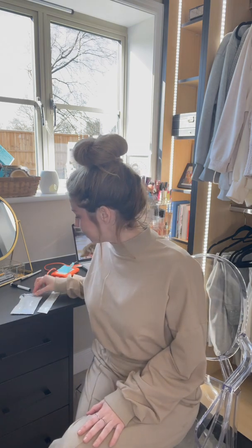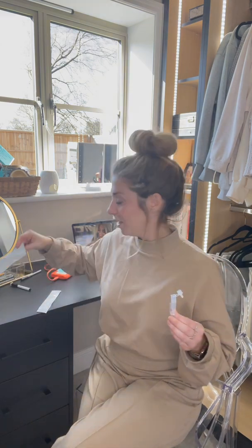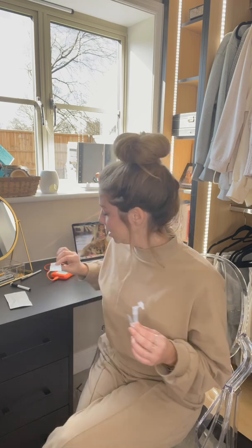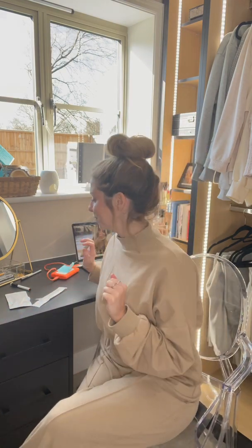I've been given this little pipette — I've already washed my hands. Obviously I don't need to put my own mask on, but you should. If you're doing this to somebody else, you have to wash your hands and put a mask on. They give you this little pipette and this little solution, and you put the solution in the pipette first. Then this is the self-test kit, and the lovely little swab that you stick on your throat on both sides and up your nose. I'll show you a step by step — it's pretty gross, but we'll see how it goes.